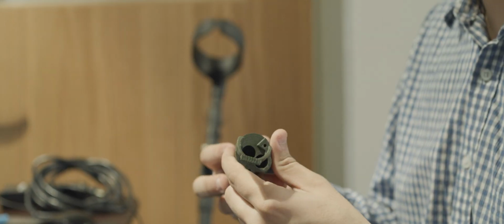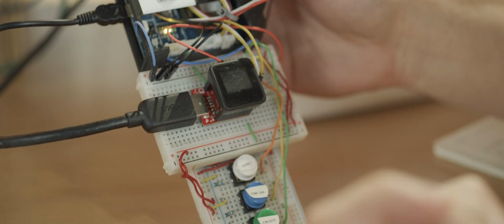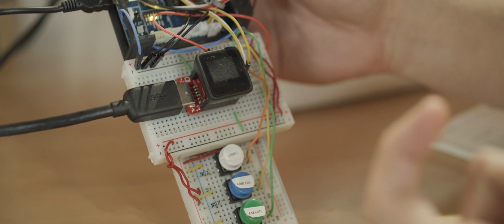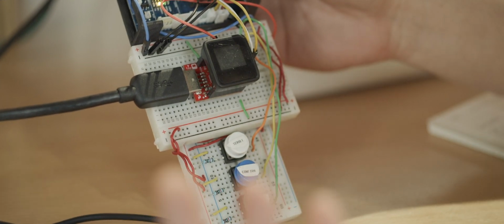So we have a similar layout to the previous design. So we still have three buttons for scrolling through different options, confirming an action. And then we have, again, a single button dedicated to triggering movement. So there's only one button that you can click that will make the device move, which is kind of what Mark's used to.